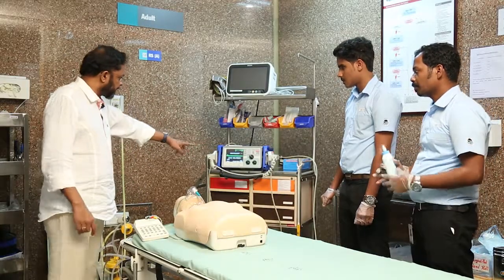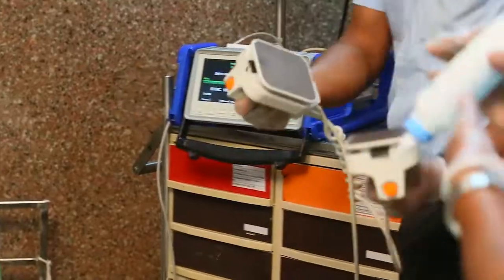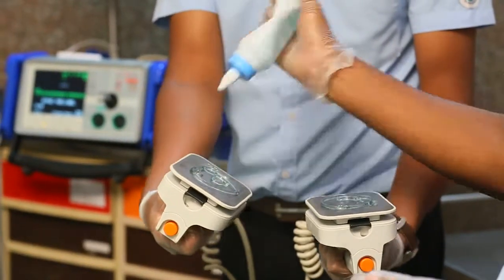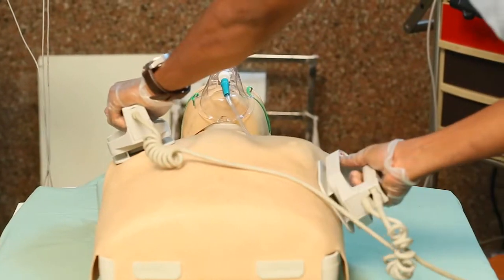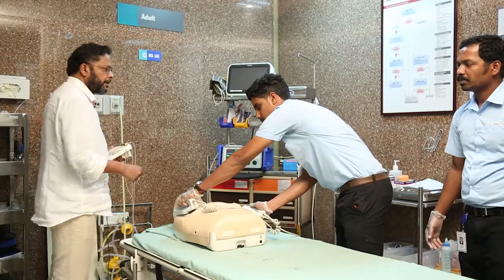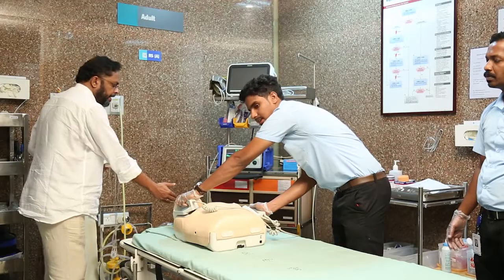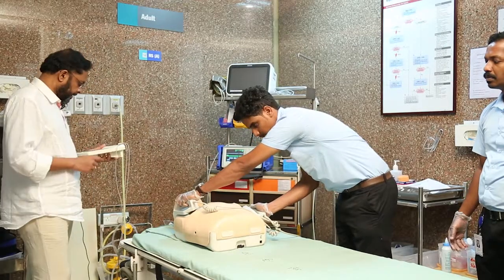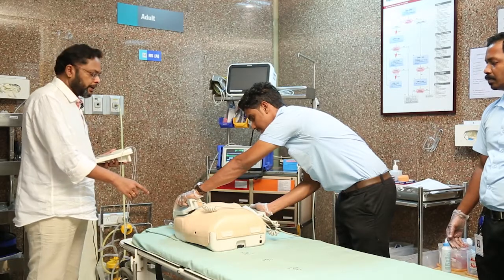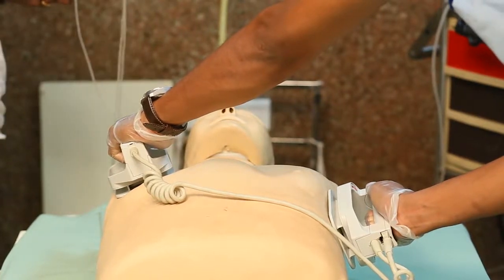After synchronization, sedation, and consent, apply gel to the paddles and place one on the right side and one on the left side of the heart. Follow the same sequence as defibrillation: I clear, U clear — oxygen must be cleared — and all clear, meaning everyone should stand clear.